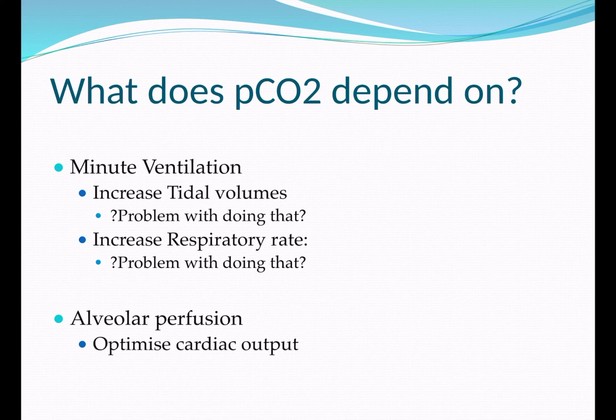We don't go above this because we know that there's good evidence that if you over-distend alveoli beyond this, you can cause damage and fracturing of the normal alveolar wall and therefore increase inflammation and therefore increase damage to the lungs, prolonging ventilation further and potentially creating irrevocable damage to the lungs. So if the tidal volume is set and your CO2 is starting to rise, the only thing that you can do is increase the respiratory rate.